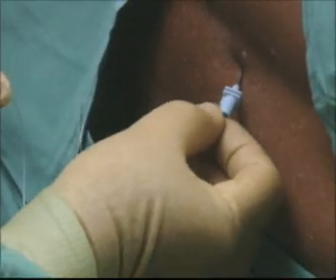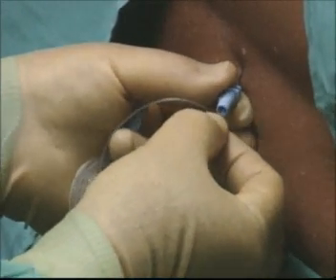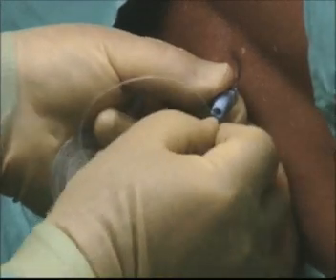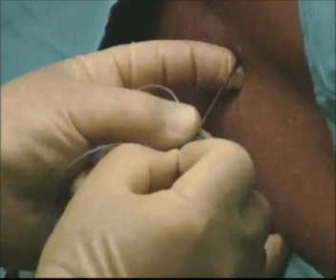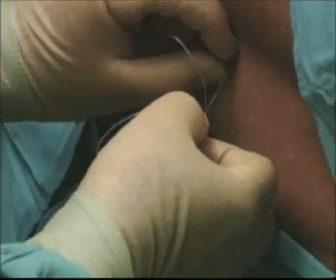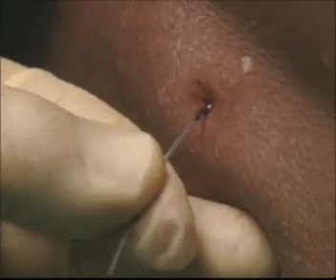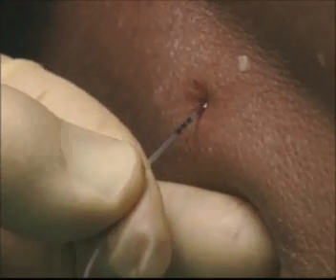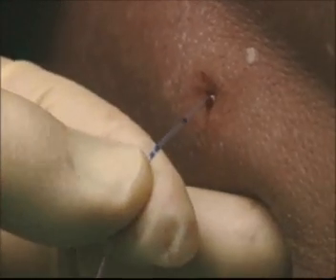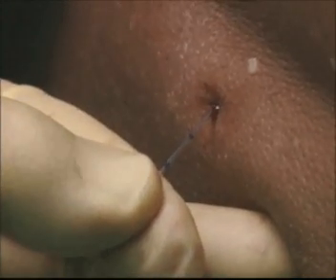The catheter is inserted through the needle and advanced until sufficient length lies within the epidural space — 11 centimetres of catheter in this case. The needle is withdrawn slowly, and when it clears the skin, the catheter is grasped firmly to prevent it being removed. The filter is disconnected to allow the needle to be removed completely. The catheter is carefully withdrawn to leave sufficient length within the epidural space; in this case seven centimetres was left, and therefore four centimetres was withdrawn.